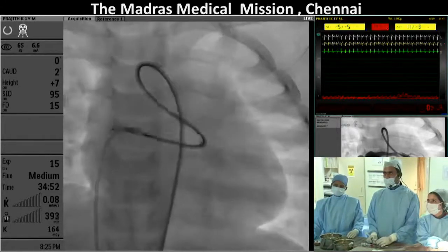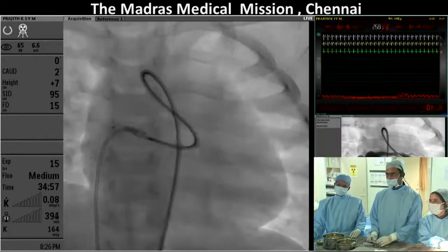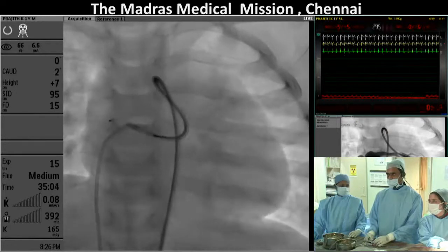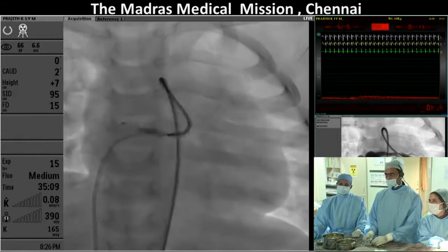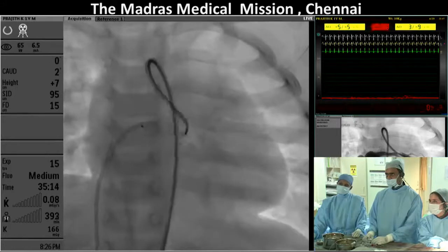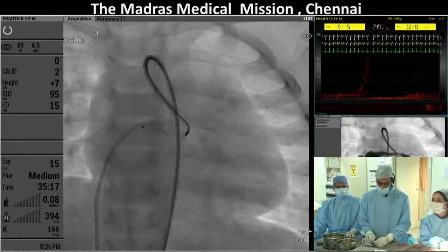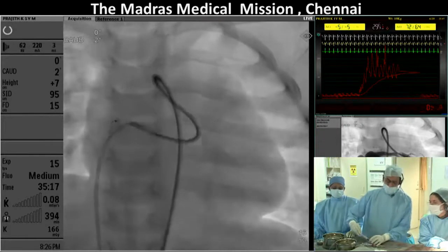So you carry on doing it, but I would have done this from the venous end because you've got better control at delivering the device without encroaching on the circumflex. Because from the retrograde arterial approach, sometimes it jumps very quickly. But you might be okay. Completely in the sac. Yep. So fluoro-store this and show this again. So now let me make one angiography.